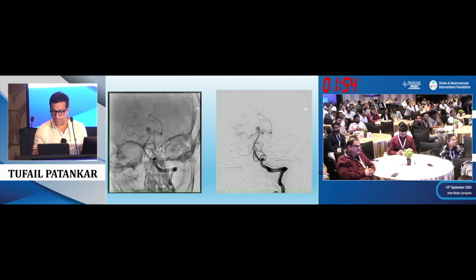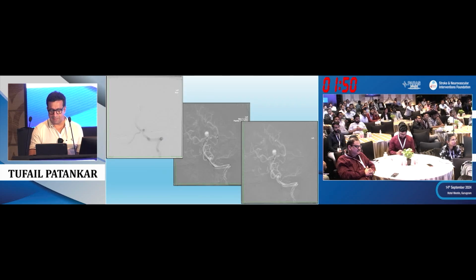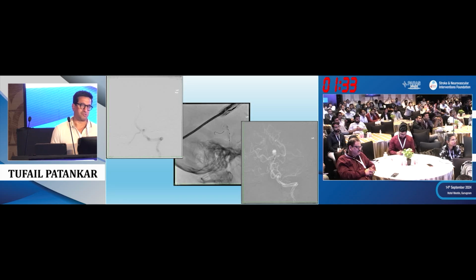I've got 1 minute, 56 seconds. And then you can see the web is in. And you can see there is a pipeline on the other side. And I know that this aneurysm will disappear with the pipeline. And Vincent correctly may ask me why I did not use a web. I had no answer to that question.